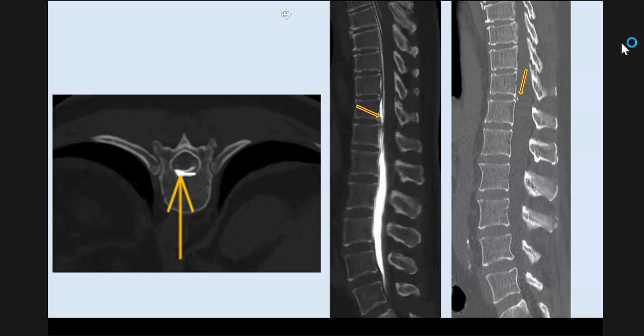In which lateral decubitus is it done, right to left? We start with left and then move on to the right. Like the first patient we showed you with the CSF venous fistula, we started with the patient lying on their left side, and it was identified on the first run. But for completion, we also did the right side.